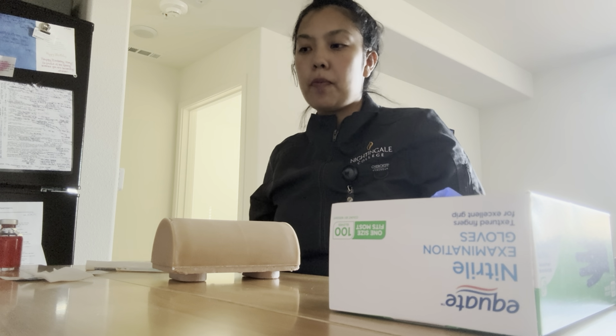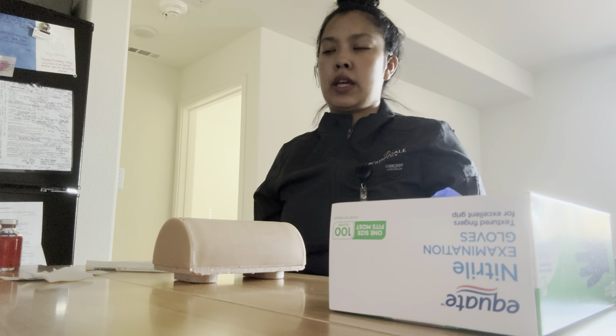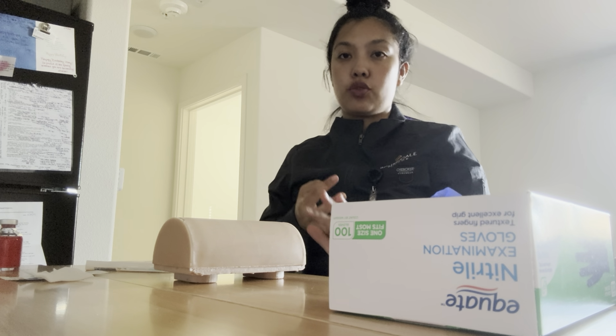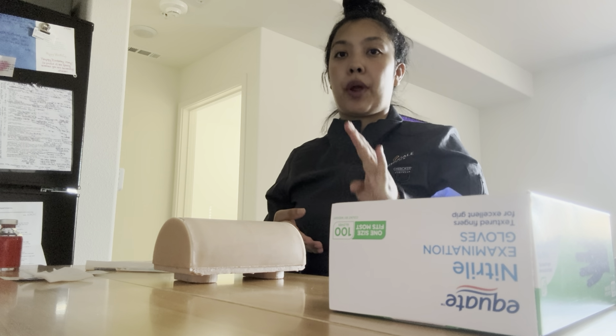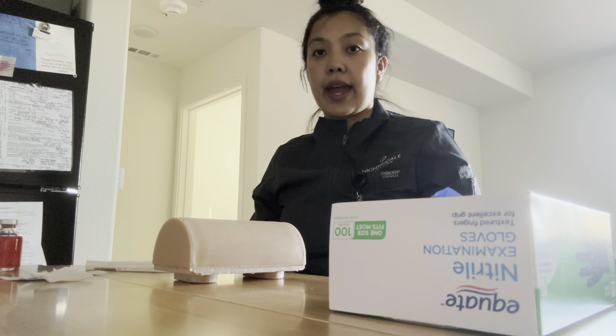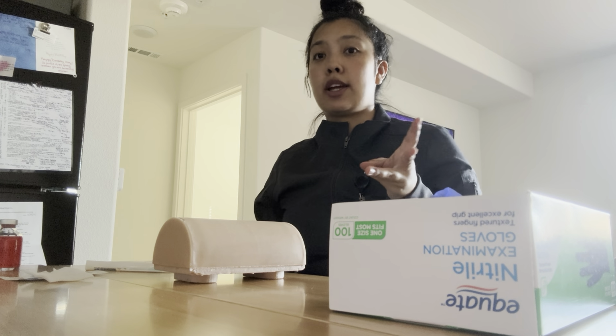Today I am going to be doing the intramuscular injection. First things first, I'm going to go ahead and read out the 6 rights of medication. We have the right patient, the right drug, the right dose, the right route, the right time, and the right documentation.